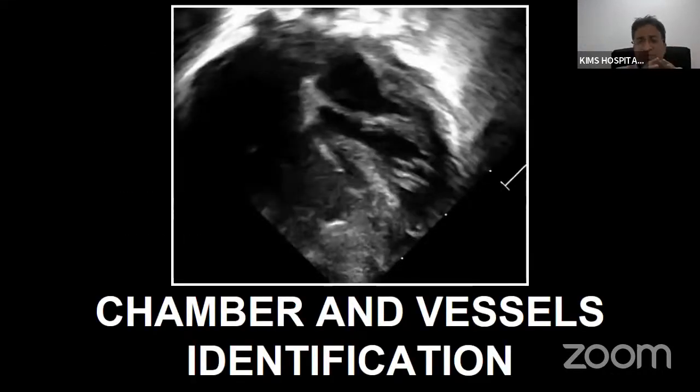Now there are two or three things. Once you go to the bedside, I'll show the knobs also. But the knobs are depth, where you can increase the depth, zoom, where you can zoom the structure, CW, PW, color, upper and lower inversion as well as right and left, PRF in scales, and gain. If you have only these seven things and are able to maintain them, that means you are able to do 80 to 90% of the echo work.